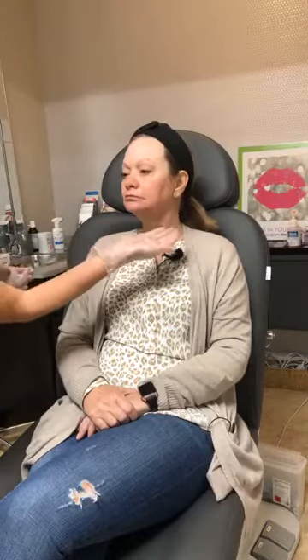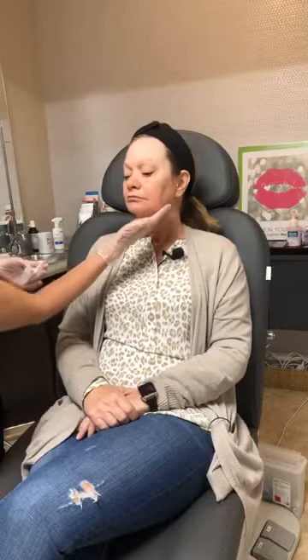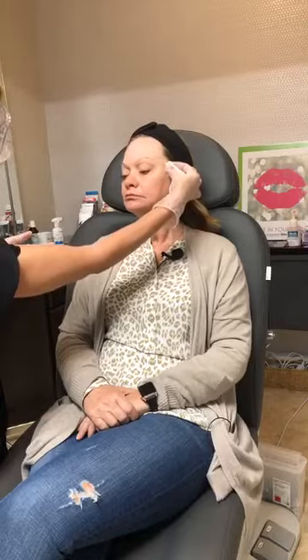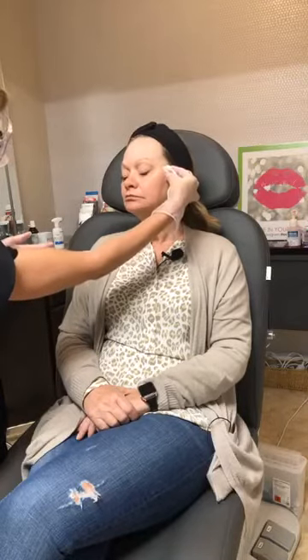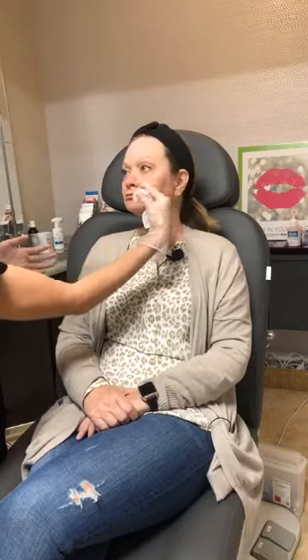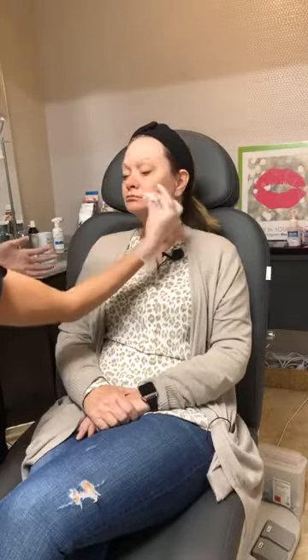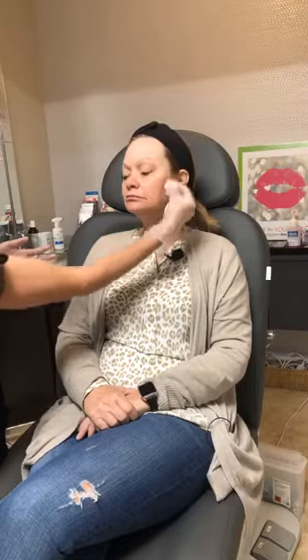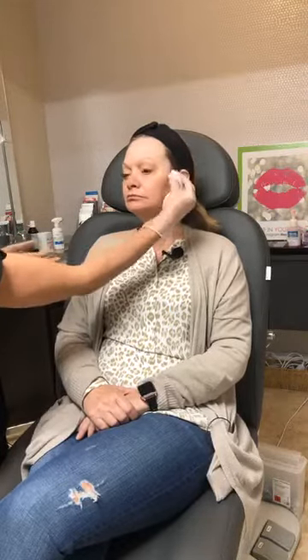So as she mentioned, she feels like she's drooping down, which again is very normal, the progression of aging. So what we're going to do is we're actually going to come back here and give a little bit of lift. And that's going to be really nice because you can see the difference under the eye a little bit. She's a little bit flat through here, but not too bad. But you can see the pull through here. Can you see that okay, Steph?